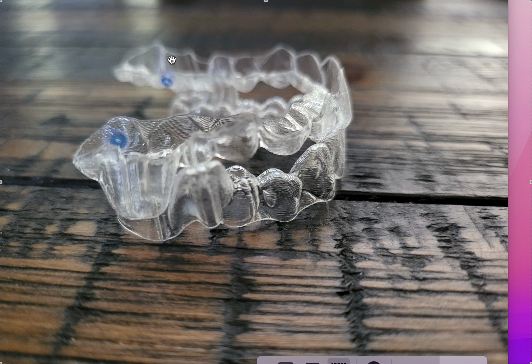And then you put them in some type of retention. Obviously, it's not going to be plain old Invisalign, and Invisalign does not have a good phase 1 retainer product yet. I don't know why they do not. It's not that hard, but it doesn't exist. So Viveras are only a comprehensive product. You cannot wear Viveras for phase 1 retention.